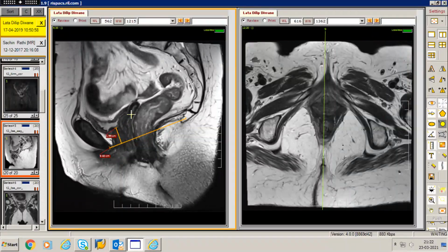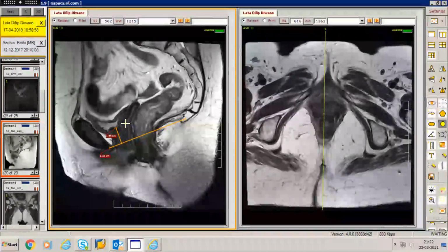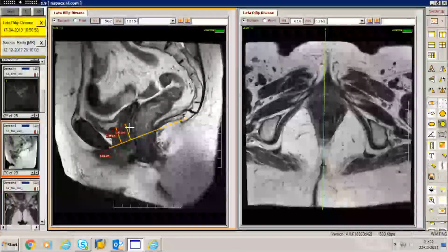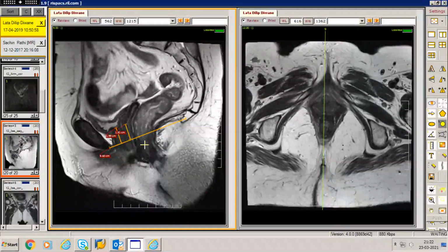When it comes to the middle compartment, we have basically the anterior inferior portion of the cervix when the patient has the uterus intact, or if the patient has undergone a hysterectomy, we take the vault, basically the superior-most tip of the vagina, as a landmark. So for the middle compartment, to understand whether there is pelvic floor descent, we would take the anterior inferior lip of the cervix, draw a perpendicular to the pubococcygeal line, and measure this distance over here.